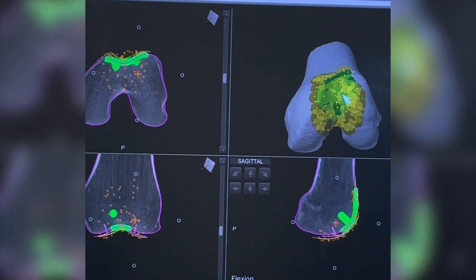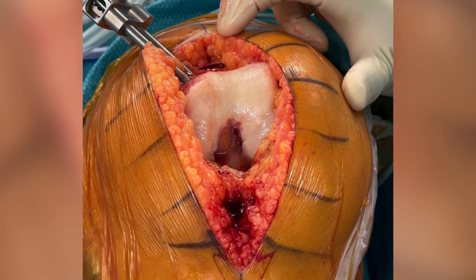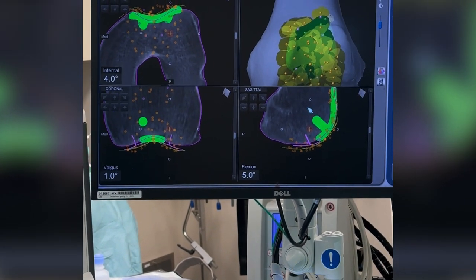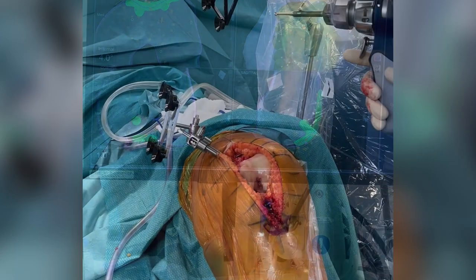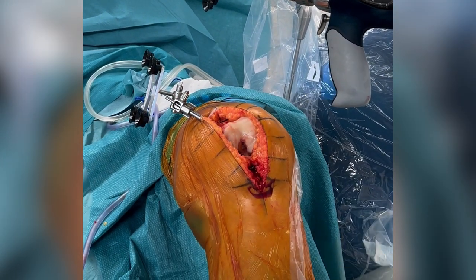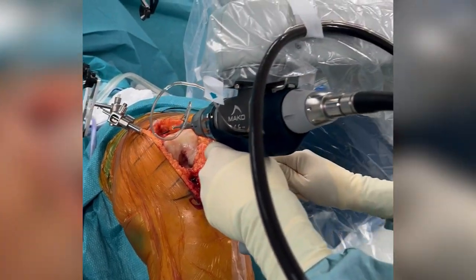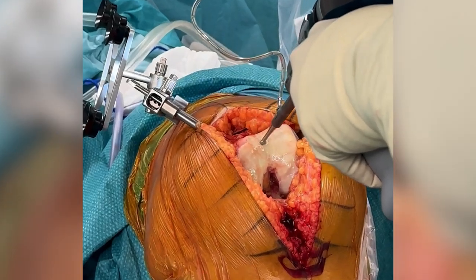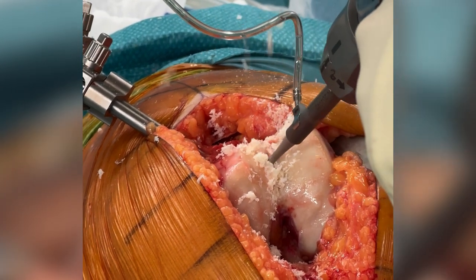Double checking the planning — seems quite good, we have a nice transition zone. Let's go and bring in the robot. Some small adjustments still, and here the robot is in. The robot has a burr connected to its end piece, and with the burr the robot will start to prepare the bed. It's a six-degree-of-freedom robot system, so you still have control as a surgeon, but the robot will make sure you stay precisely within the required boundaries.